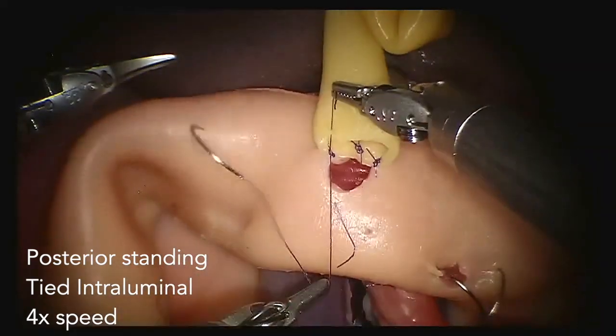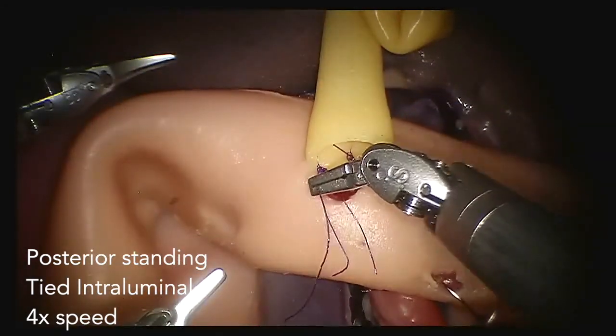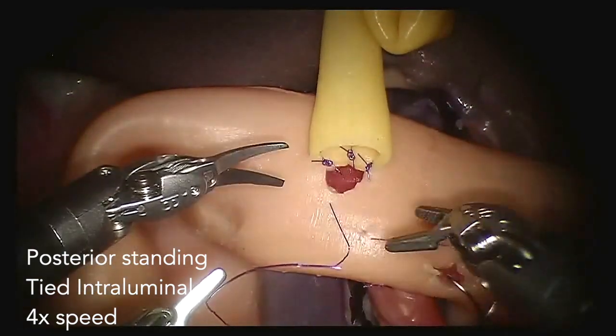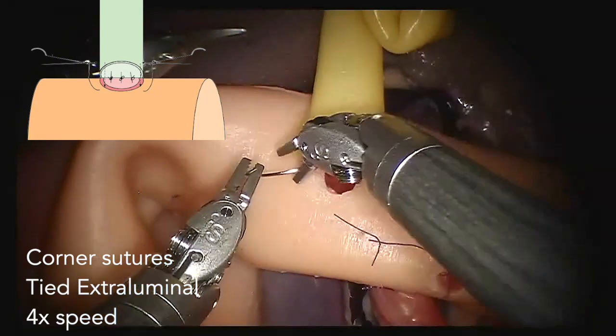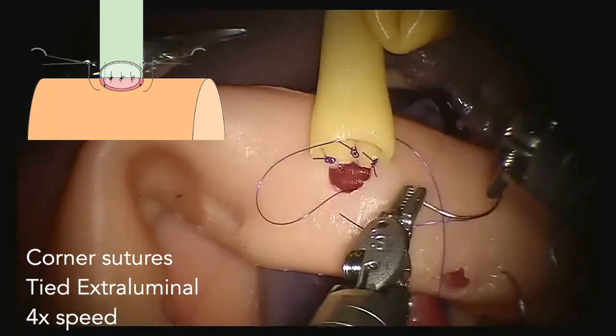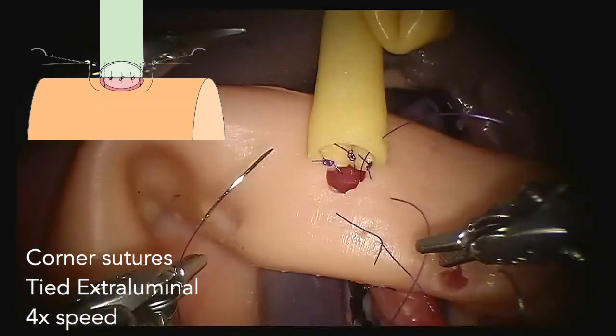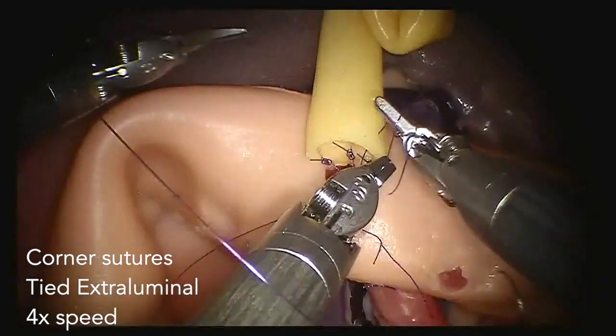Now we have completed the standing sutures of the posterior row and we move towards the corner sutures. The two corner sutures are tied extraluminally. From here on, you should take great care not to make any strictures, and always keep the exposure of the posterior duct.